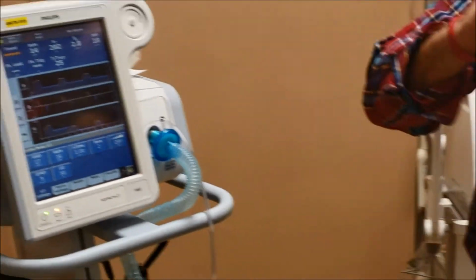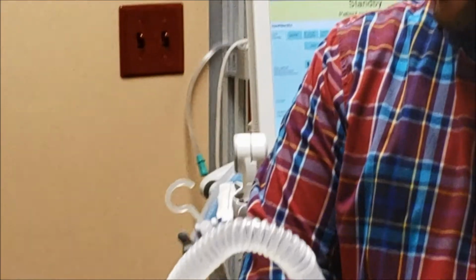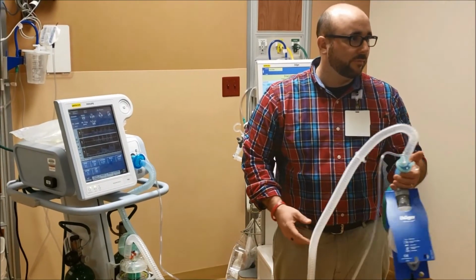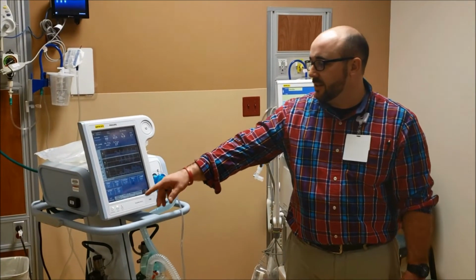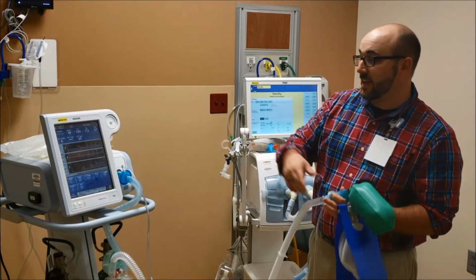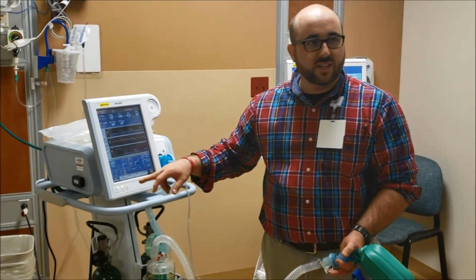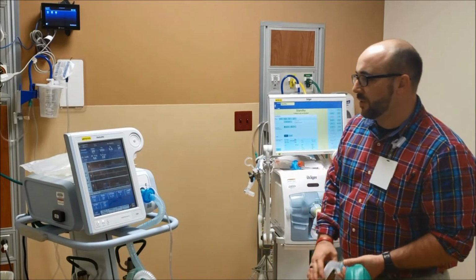So you hear the constant low pressure, and it's going to fluctuate up if the patient starts a breath. There you go, you can see it's going to support their spontaneous breaths. And if they don't take a breath, it's going to give them that nice waveform of, right now, 17 over 9. So what's your common setting you guys get? 12 over 6 or something? I think if they ask for this, that's kind of our generic go-to, even in the respiratory world. So there's 12 over 6.